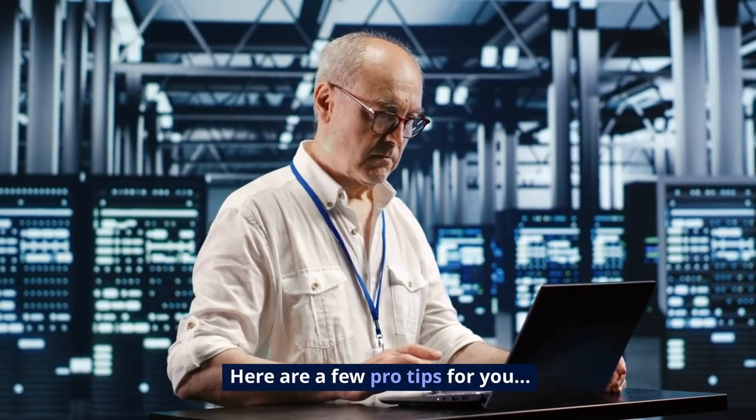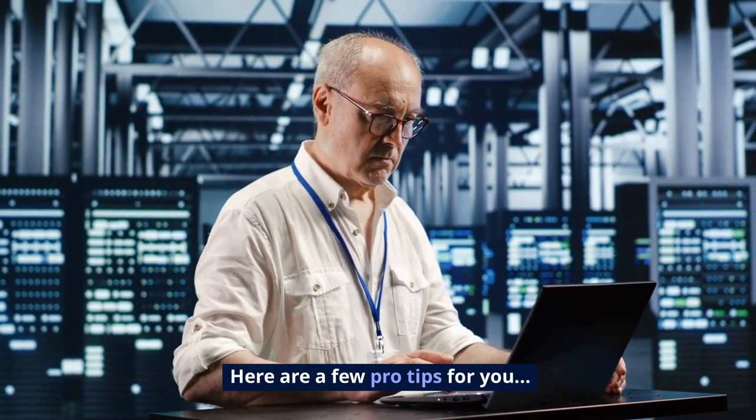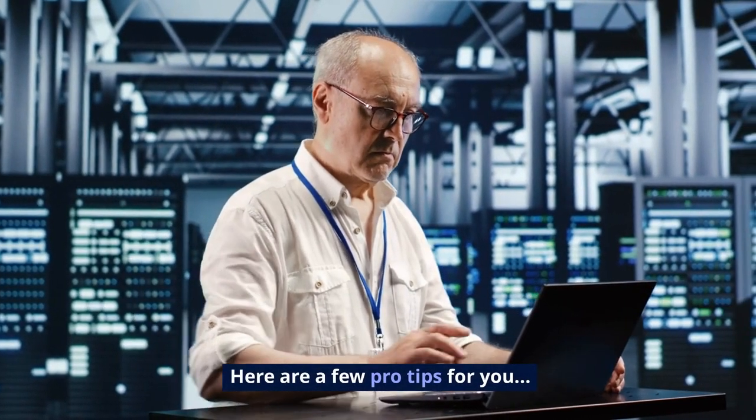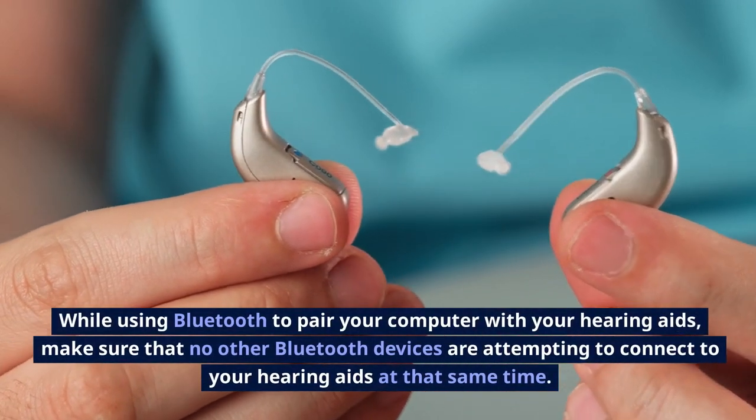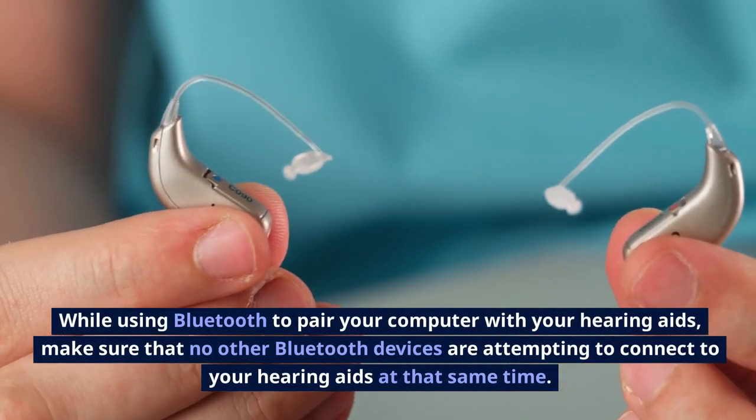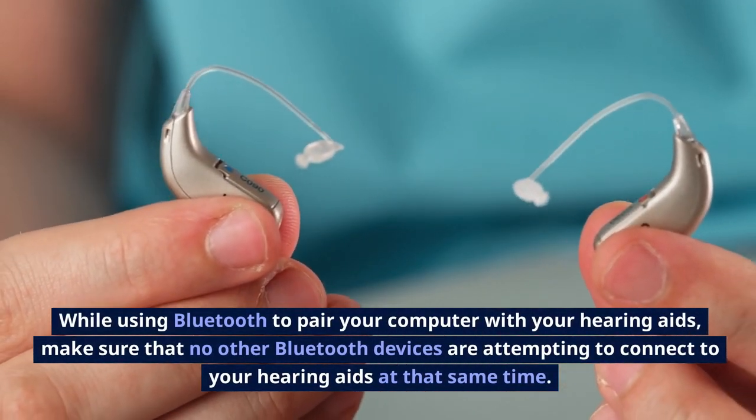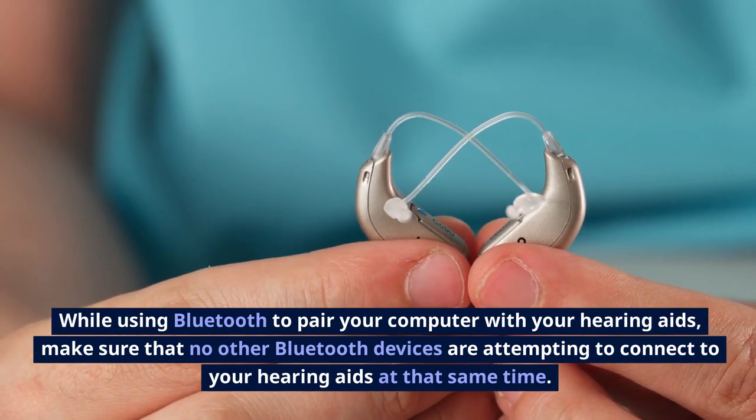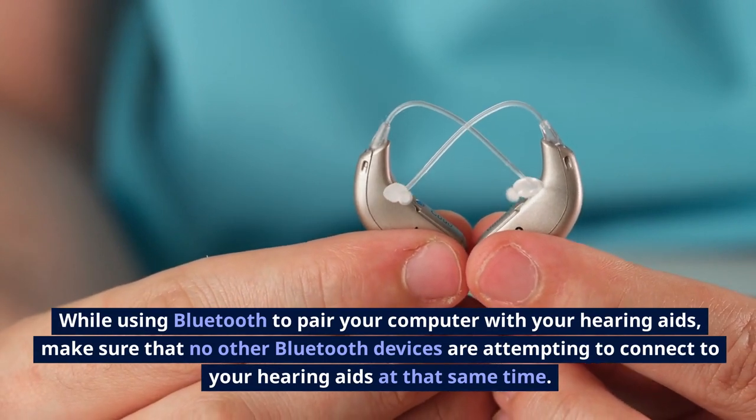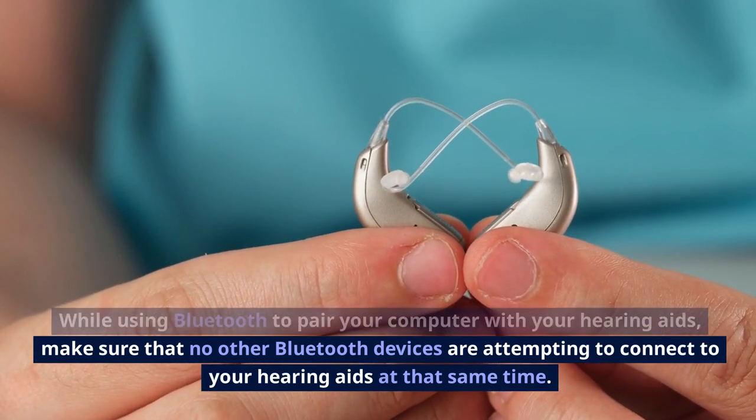Here are a few pro tips for you. While using Bluetooth to pair your computer with your hearing aids, make sure that no other Bluetooth devices are attempting to connect to your hearing aids at that same time.